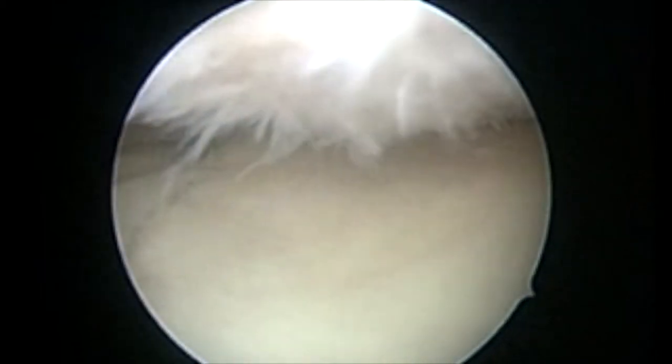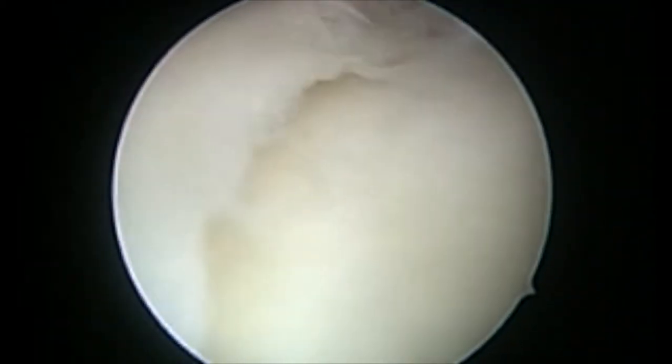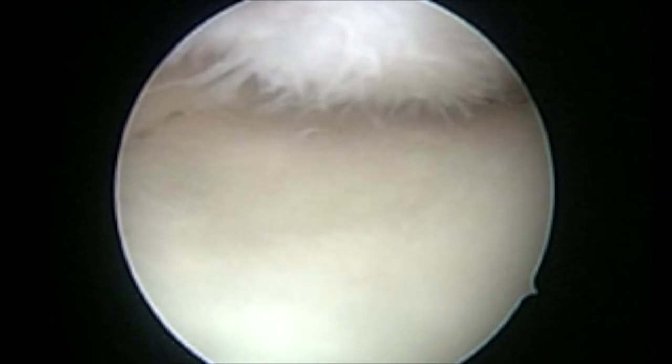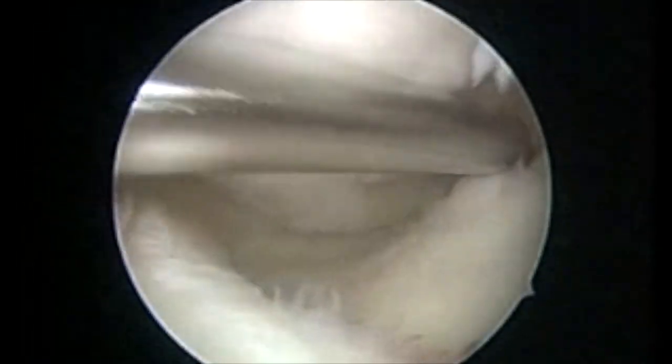One of the theories behind the formation of popliteal cysts is the overproduction of synovial fluid due to intra-articular pathology. Arthroscopic assessment and treatment gives us the opportunity to address this intra-articular pathology.